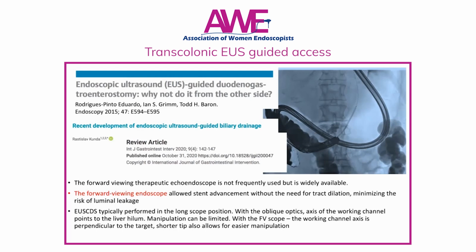And Todd Barron, in his case study, showed that for even biliary drainage, stent advancement was possible without needle tract dilatation and minimizing the risk of luminal leakage.